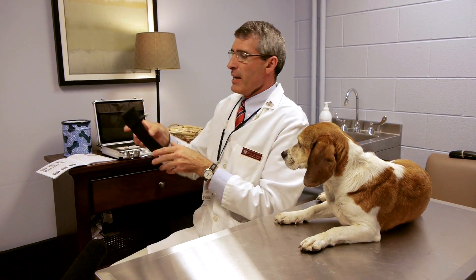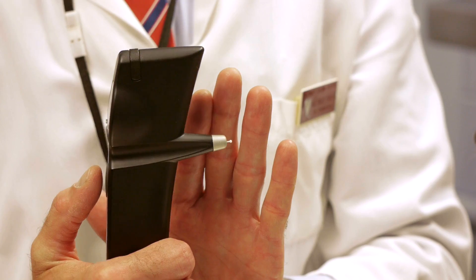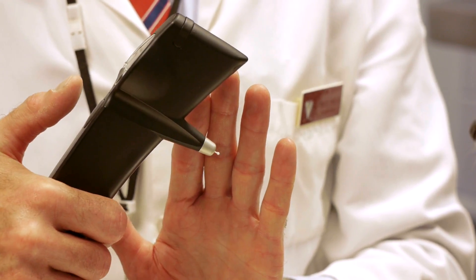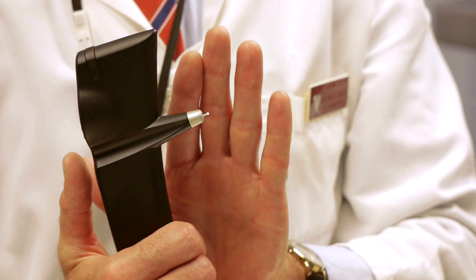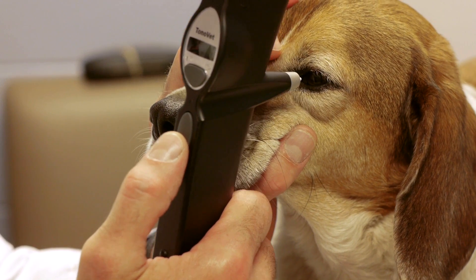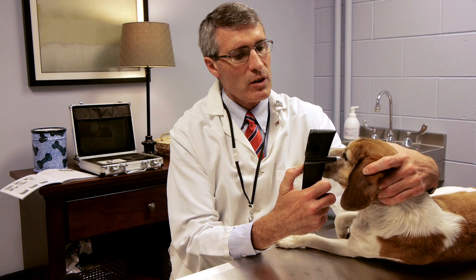The instrument needs to be held with the pen parallel to the floor. If you have the instrument too far bent down, it gives you an erroneous reading. If you have the instrument pointing up, it gives you an erroneous reading. The idea is to have the instrument close enough to the eye, and when you press the activating button, the pen will be shot out and touch the cornea.